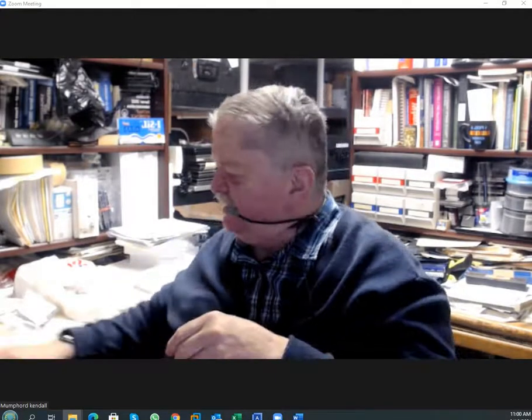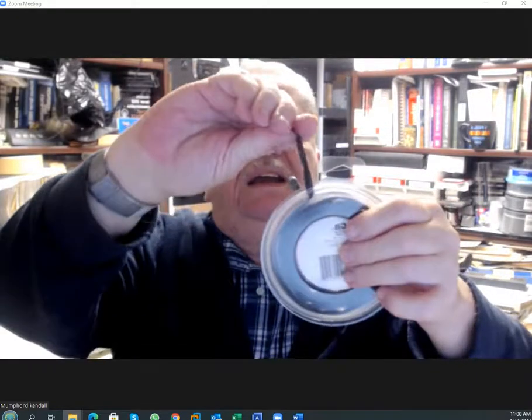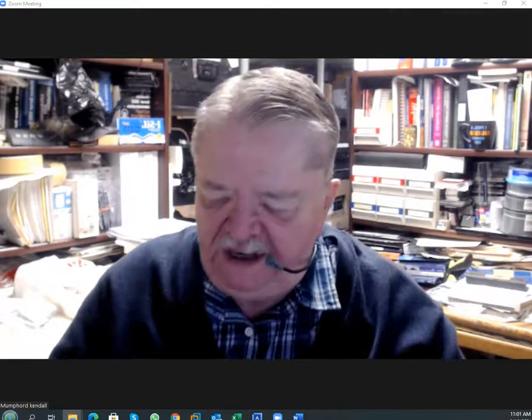Now another problem that you can have is you may have a pair of glasses that have this part of it might have a little crack on it. It's broken, and it would be very difficult to tolerate. And so what I do is I have this called shrink tubing, and a little roll of this is in the toolkit in the optical case. What I'm going to do is I'm going to get a pair of scissors out, and I'm going to cut off a little section of it like this. And there's a little section and then what I'll do is I'm going to put it on this pair of glasses right here.